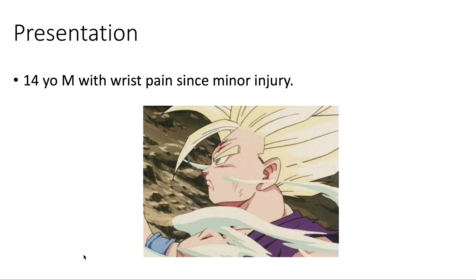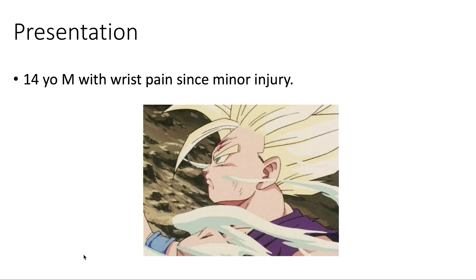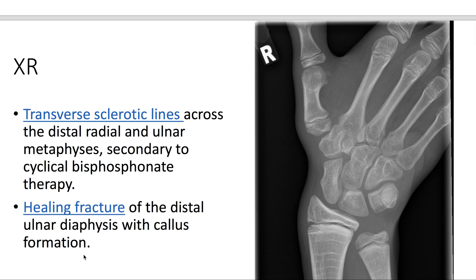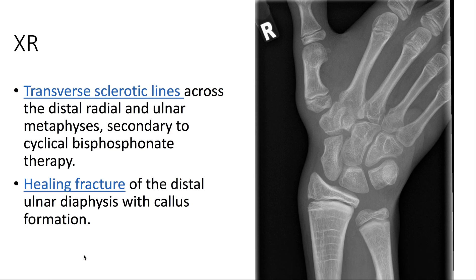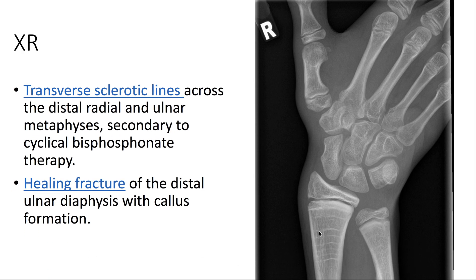Presentation: we have a 14-year-old male with wrist pain since a minor injury. On x-ray, we see transverse sclerotic lines across the distal radial and ulnar metaphyses, secondary to cyclical bisphosphonate therapy.